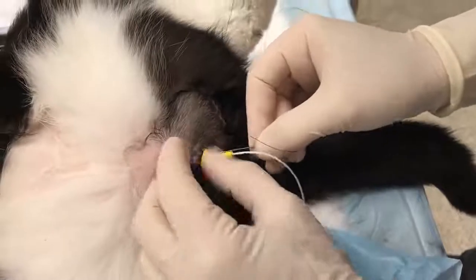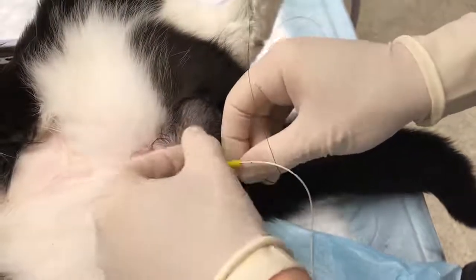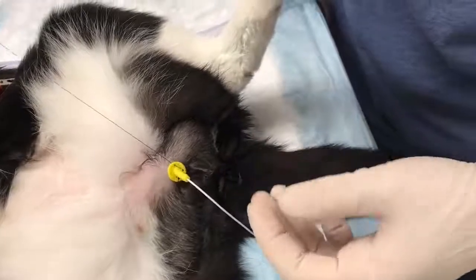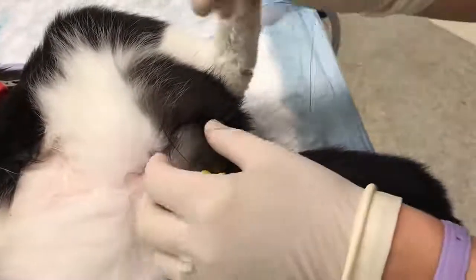Here we are seeing the process repeated. Our 3-0 nylon suture attached to our needle is passed through a large hole in the base of the suturing device, then through the skin of the prepuce, and back up through one of the large holes, and then the suture is tied.